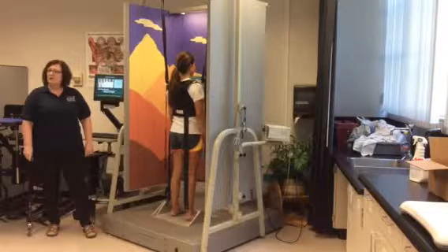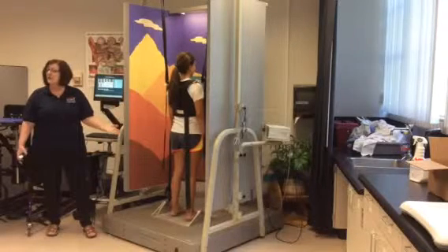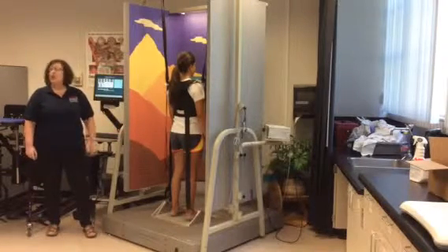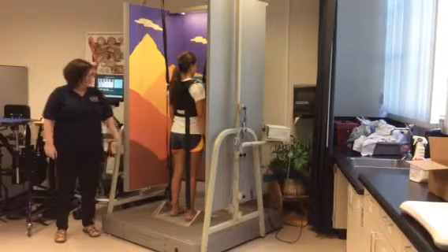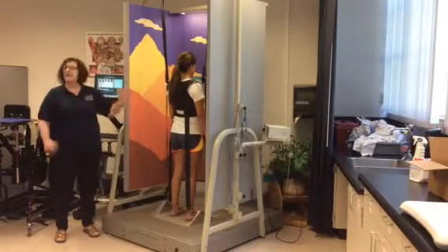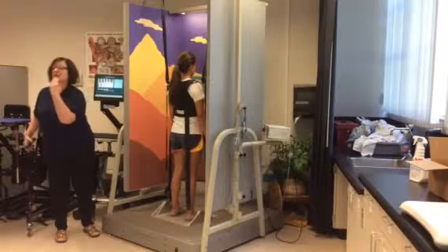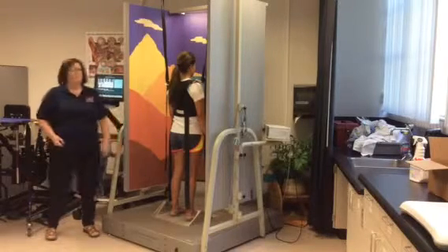I'm putting a motor stimulus, a stretch, into the system. What should happen? You should get a quick response, right? And this is a sub-threshold stimulus, so it shouldn't be hard at all. So is she using technically a hip strategy? Technically, what she's using is, as we're going forward, it's stretching the gastrocs, and so she actually has to generate a posterior muscle response in order to bring herself back up to upright. So I'm destabilizing her surface. She has to be able to bring herself back to upright.